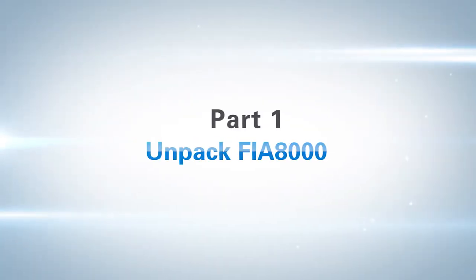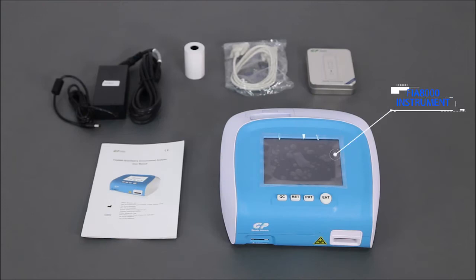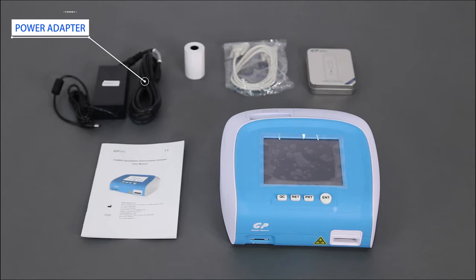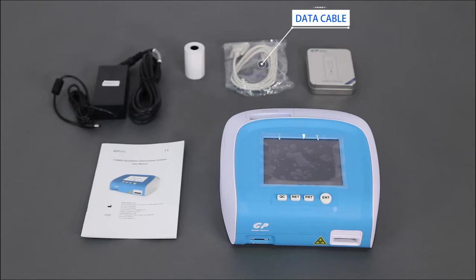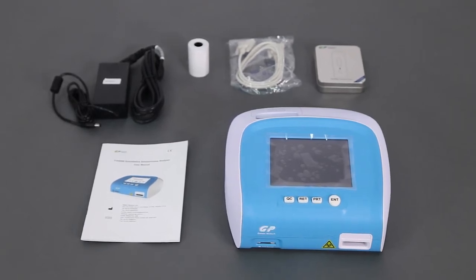Part 1: Unpack FIA 8000. The package includes the FIA 8000 instrument, a power adapter, a data cable, a QC card, a roll of printing paper, and a user manual. Please check the items according to the packing list.